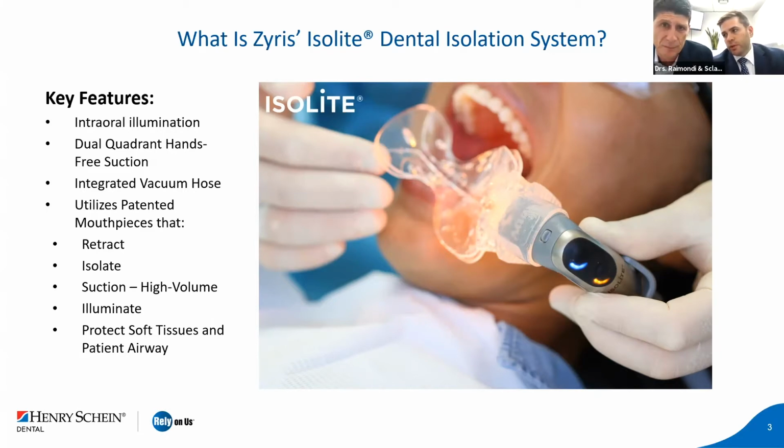You can't check occlusion with it, right? So when you're prepping a crown, you can't do it. Right. I just don't find a way to do that, right? Yeah. How are you going to do it? I start my crown preps with occlusion reduction. How can you do that with rubber dam on? So you do occlusion reduction, then put the dam on, but you don't have like.